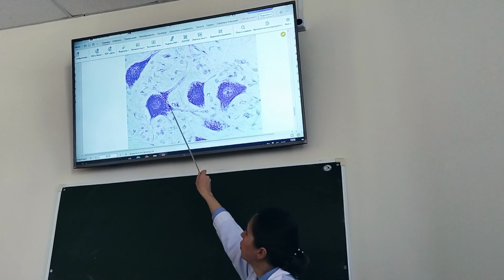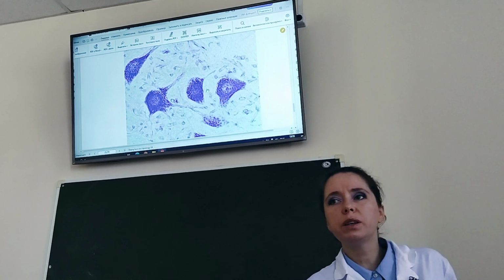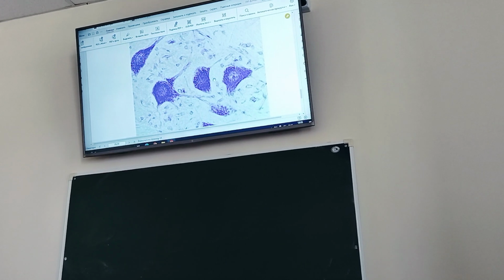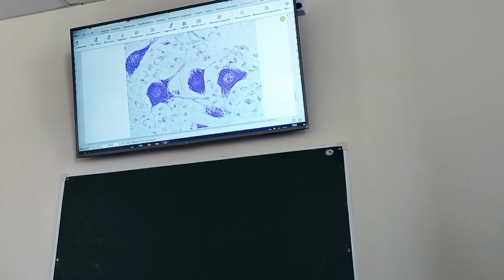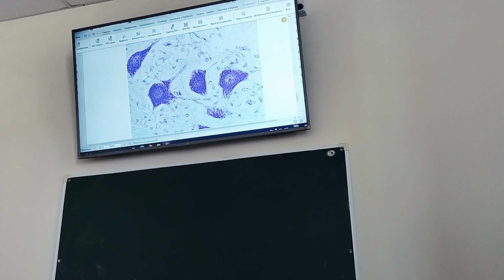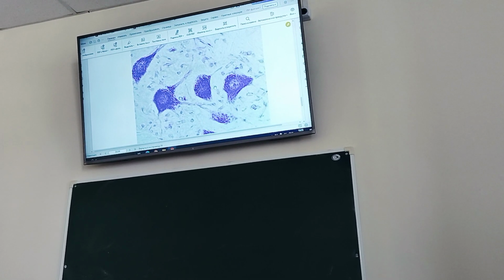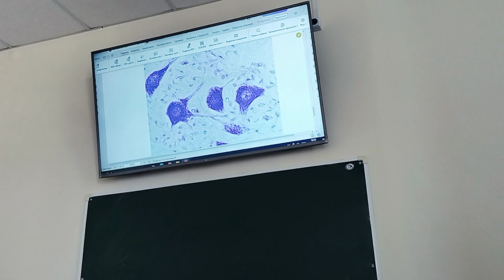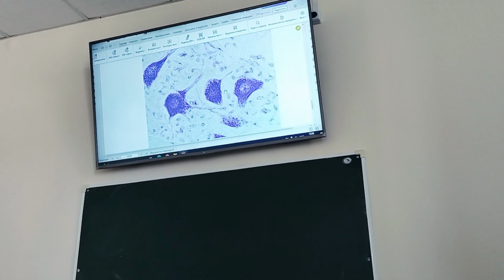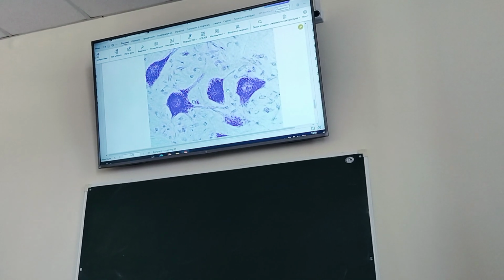Nissl bodies or tigroid totally fill the perikaryon, and also include the initial portions of dendrites. Axons remain invisible in this case. In between them, I can also notice nuclei of protoplasmic astrocytes, because the location is gray matter of the spinal cord, which contains the protoplasmic type of astrocytes. Generally, that is all that you need.